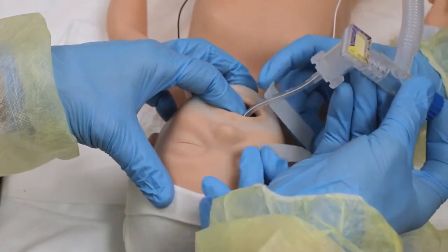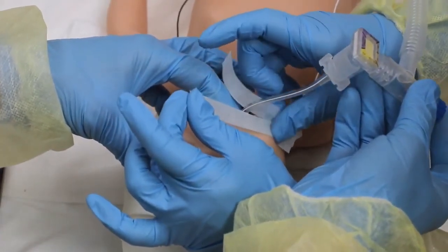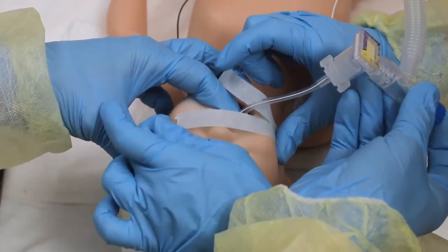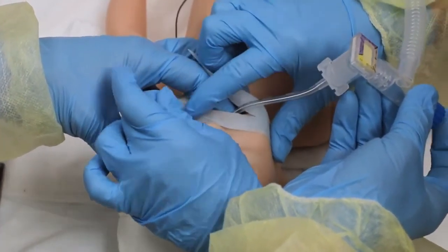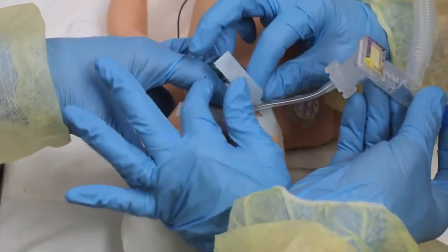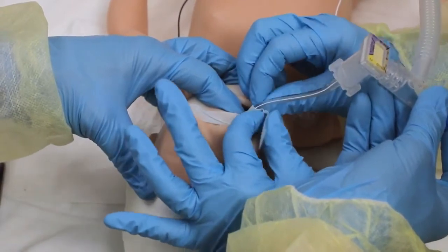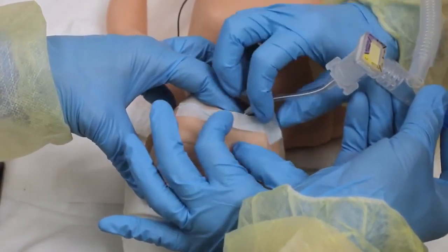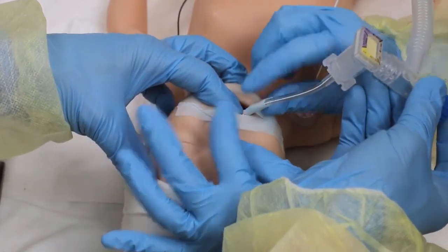Secure the tube. If using tape, tear it so that it looks like a pair of pants. Place the uncut section on the baby's cheek close to the corner of the mouth and the upper leg of the tape above the baby's lip. Wrap the lower leg of tape around the tube. Leave a small tab of tape folded over at the end to assist removal.